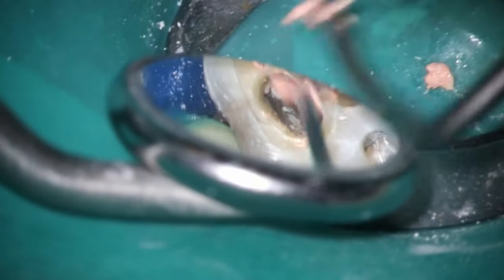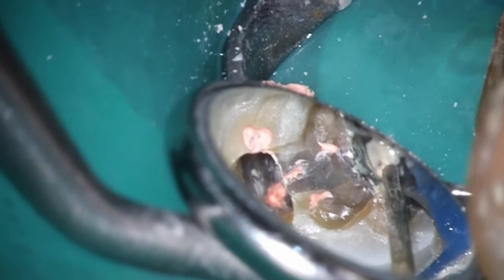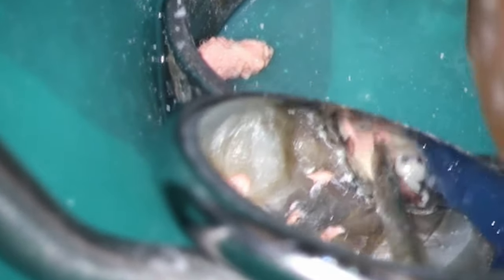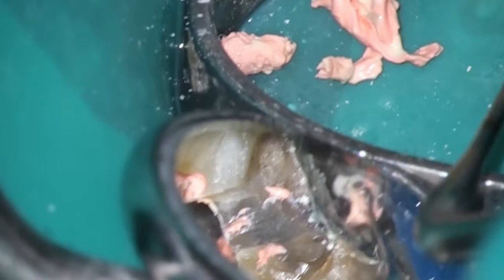I didn't really notice that it was a type 2 until we took the final x-ray — sometimes that happens. Sometimes when you put the suction in it clearly drains out the other canal, sometimes it doesn't. You can use paper points, but really it doesn't affect too much as far as obturation technique with a squirt, if you have the right technique. You can always pull it out and put a cone if you need to. Sealing everything up — not too bad. When it's this deep it does add complexity. The two distals do join, so I was able to fill one and take care of it.